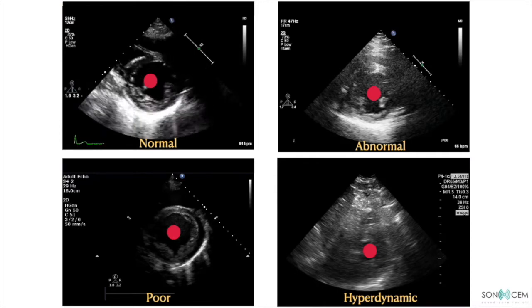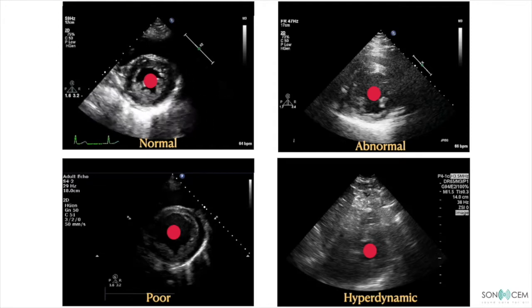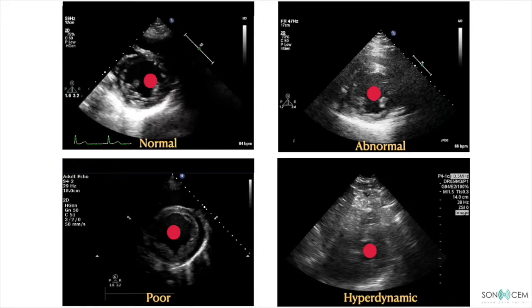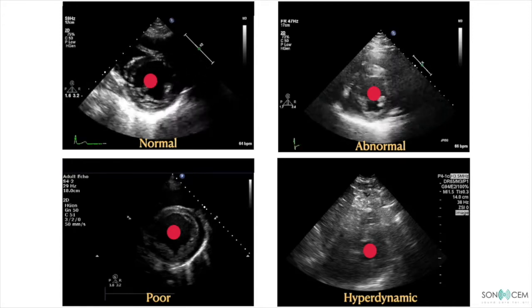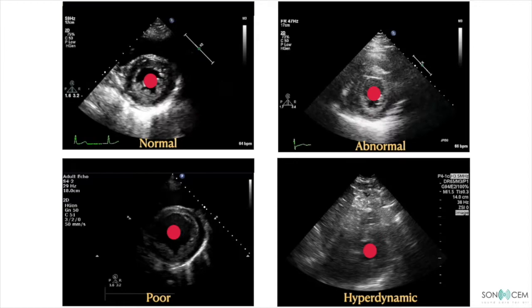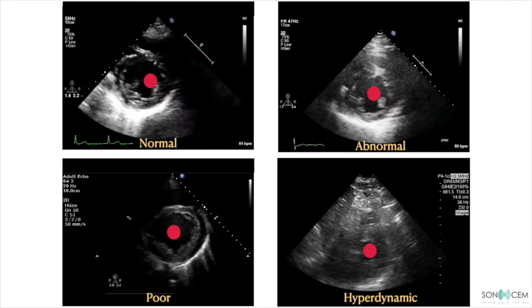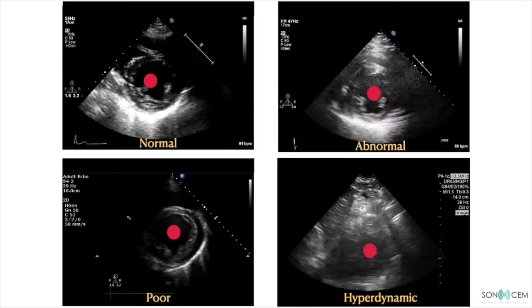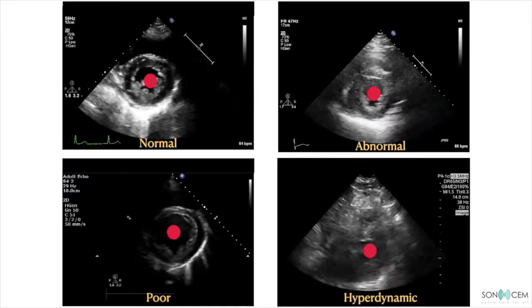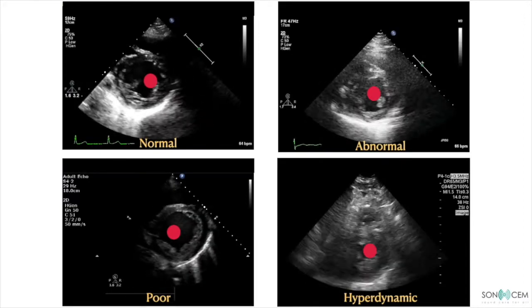These clips denote a normal contractility, where you can see the LV or the myocardium shorten and also thicken simultaneously towards the center, and the volume change is around 50%. The right upper clip shows abnormal contractility, while the left lower clip shows a poor contractility, where you can see the heart is hardly contracting. The last clip, the lower right side, shows an obliteration of the LV and also RV during systole, which denotes lack of volume in the chamber. So this is a pattern of hypovolemia.